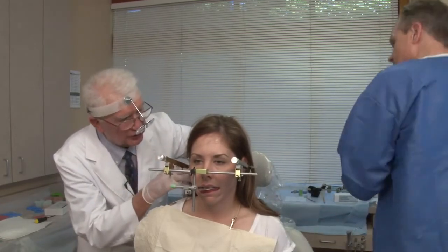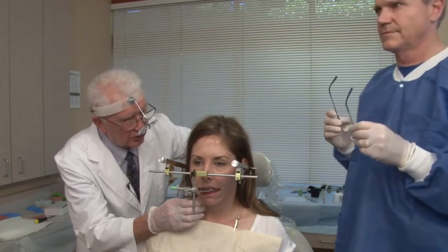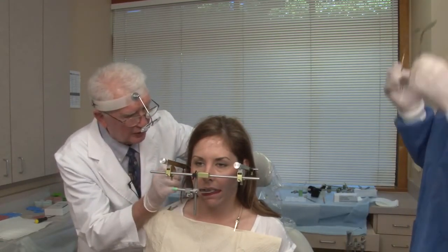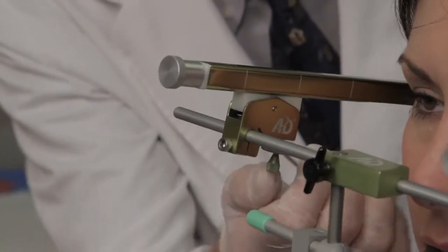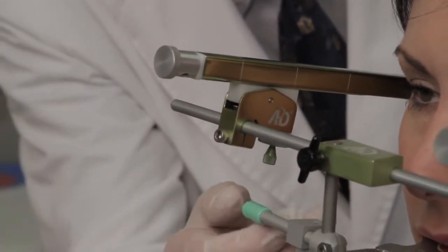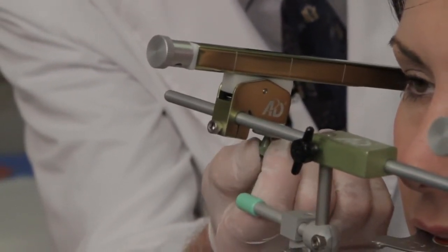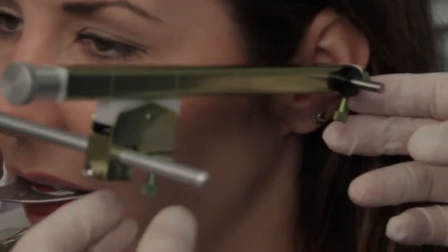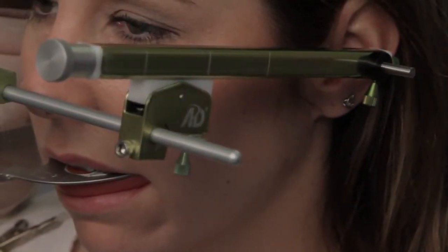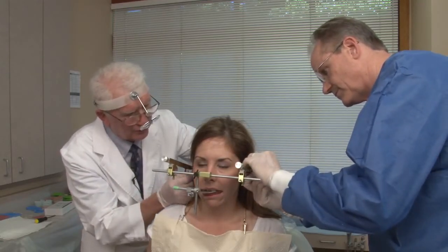And then Dr. Mills and I will do adjustments of the sidearms to put the stylus points on the axis. Okay. Now you want to be able to move the stylus pen in and touch right on the red dot. Don't push the skin in, just touch it very gently. Once you've touched it, lock the stylus pen. That's the lower screw. Lock the stylus pen in that position.